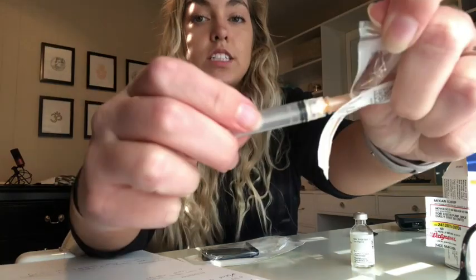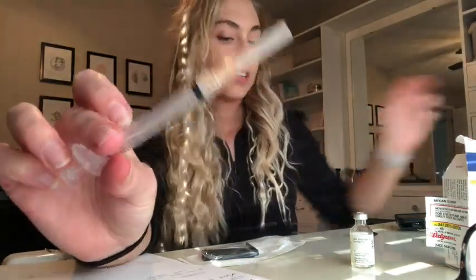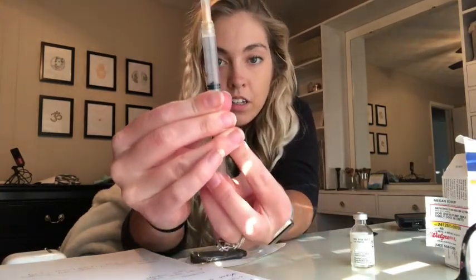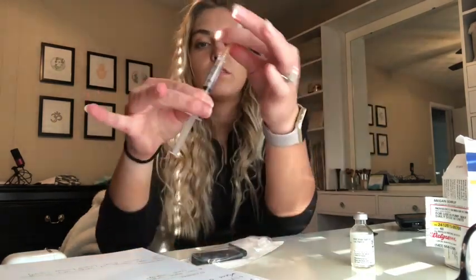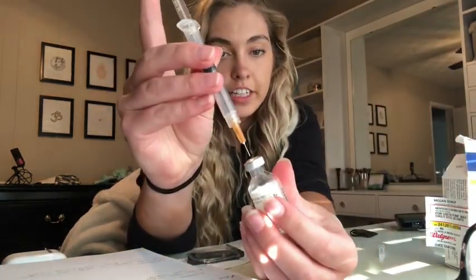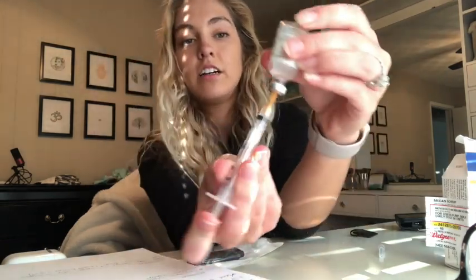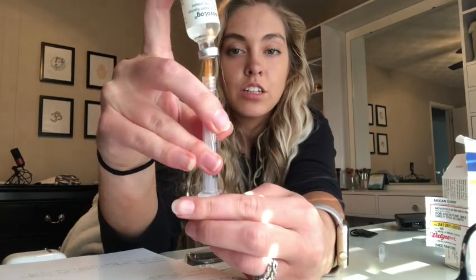So just like that, just going to twist it in place and then you have your syringe and then I just pull up how much insulin I'm going to need. Unscrew that. So then you just take the syringe, stick it in your vial of insulin and press all that air into the vial, flip it over and start to fill your syringe with insulin.